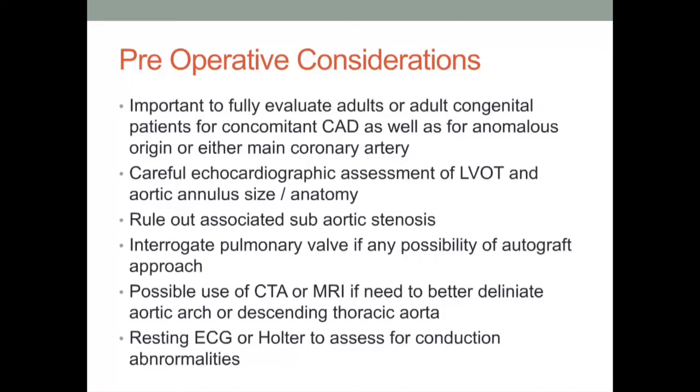Careful review of the preoperative echocardiographic evaluation will allow for strategies to be devised to avoid patient prosthesis mismatch. Concomitant subaortic stenosis can also be identified to delineate the need for associated myectomy or myotomy interventions. In addition, echocardiographic evaluation can allow for a better recognition of potential post-stenotic ascending aortic dilation, as well as a thorough investigation of pulmonary valve architecture for consideration of autograft use.